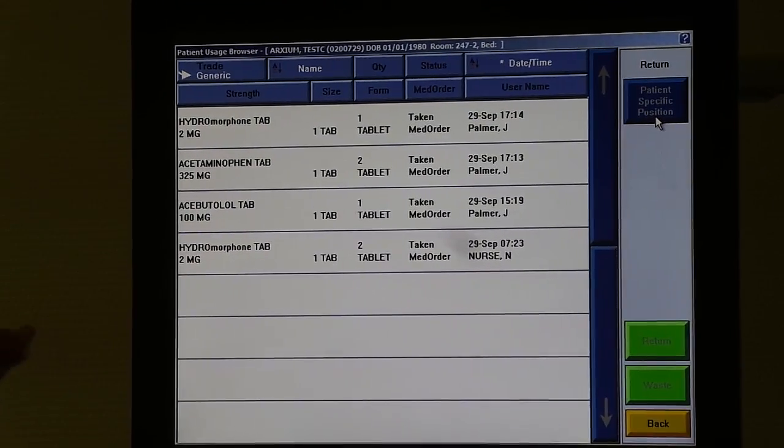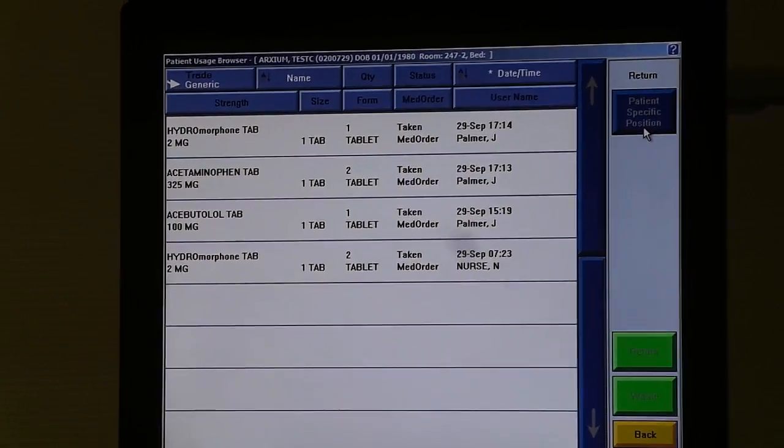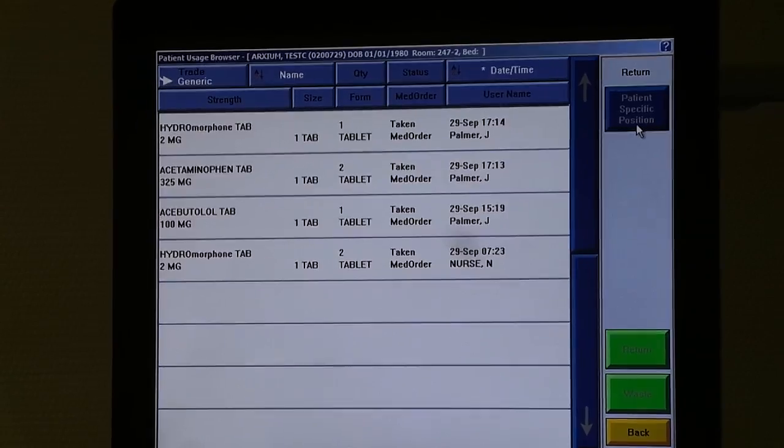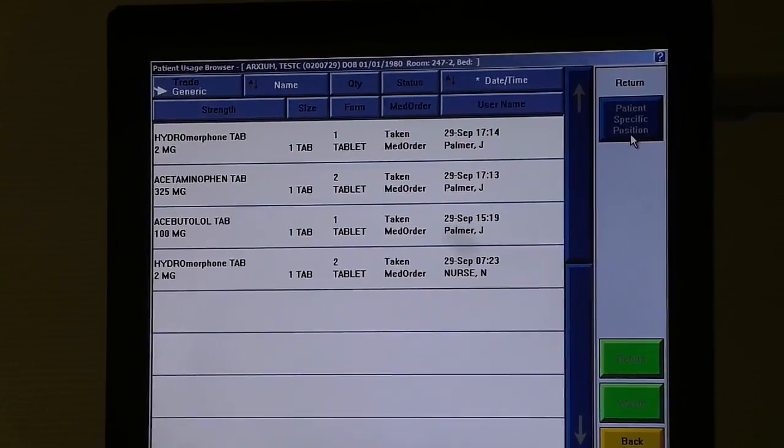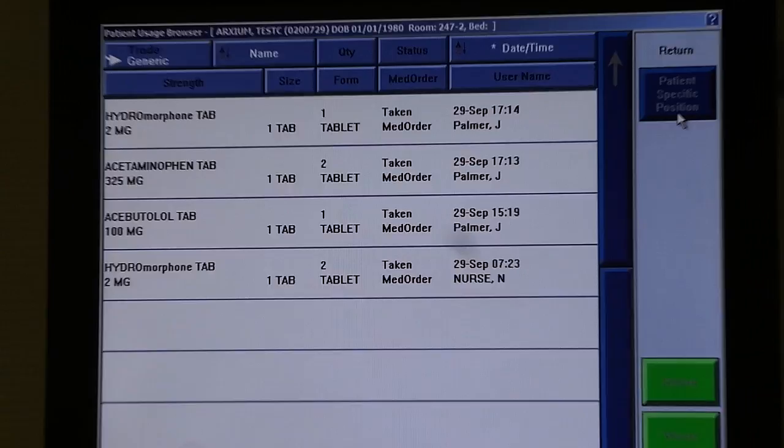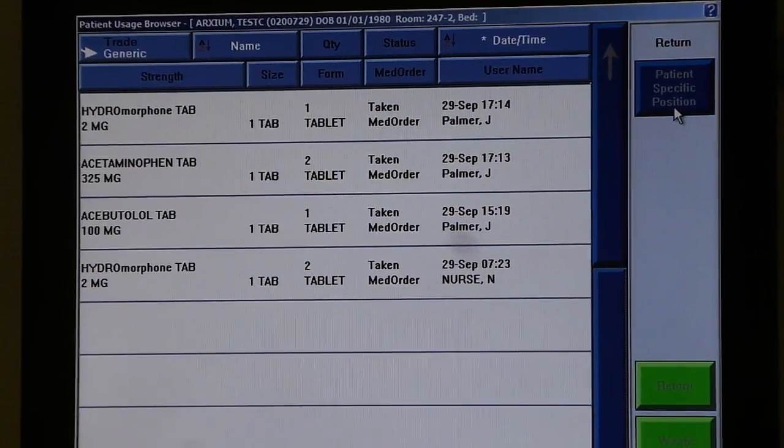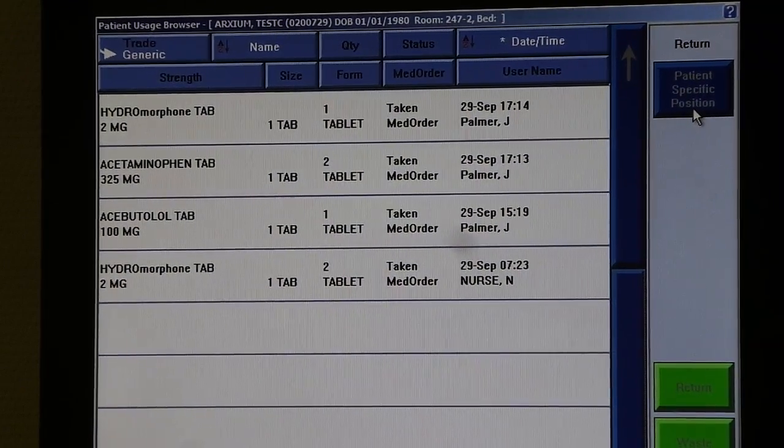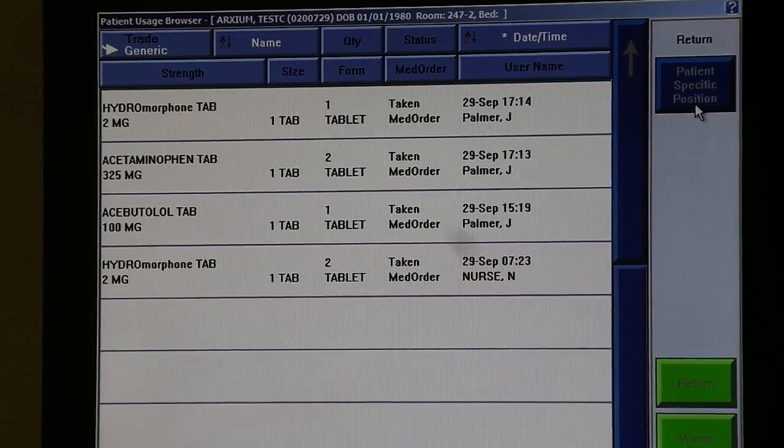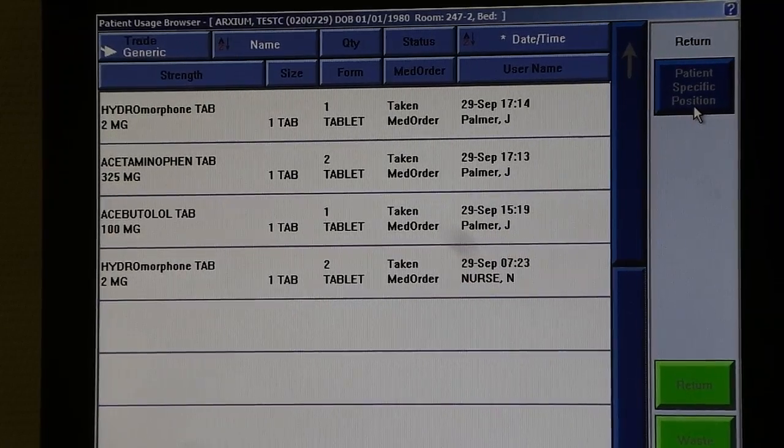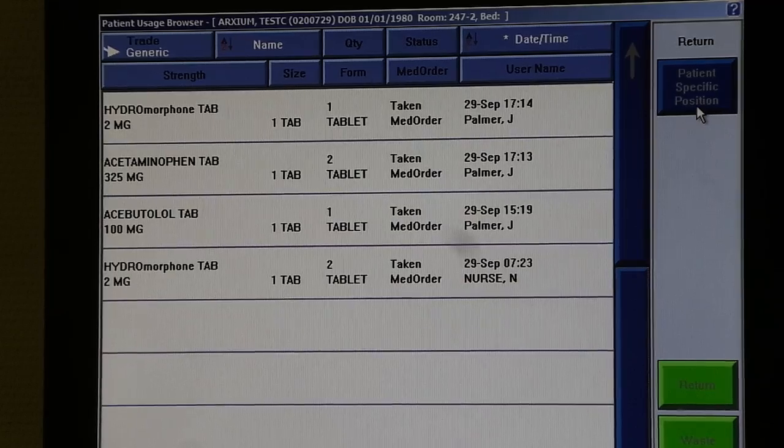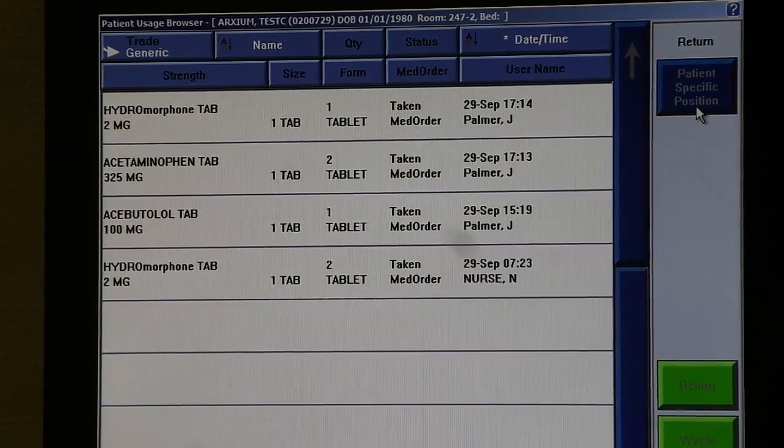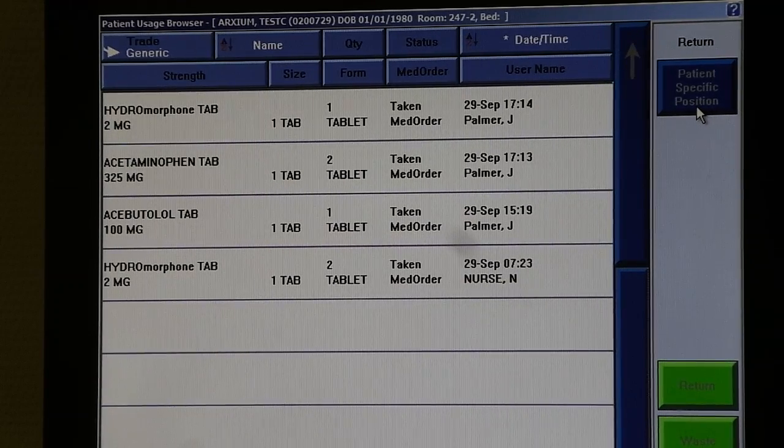This will show you all of the medications dispensed in this screen. Note if you are working in the emergency room or you're not sure about something that has previously been dispensed for a patient, this would be a great double check for yourself to see if the medication has already been given. This may help to prevent duplicate medication errors from occurring.